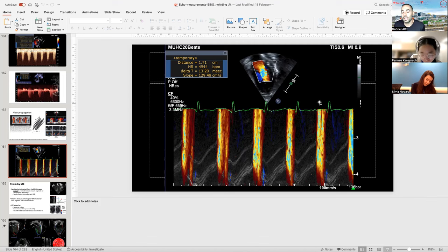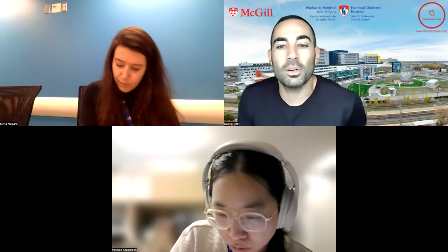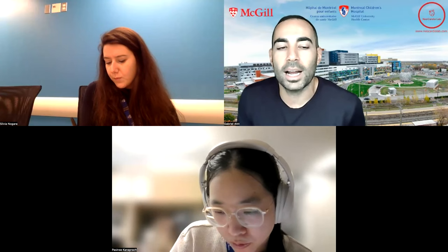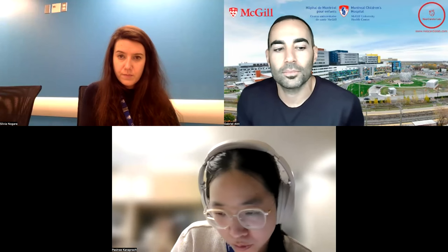This marker is not something we get on our echoes, to be honest, so it's not something you'll be able to measure anyway. At least up to now, we were not including this in our echoes. It's also been abandoned in the recent literature. Most guidelines on diastolic dysfunction don't even include that anymore.